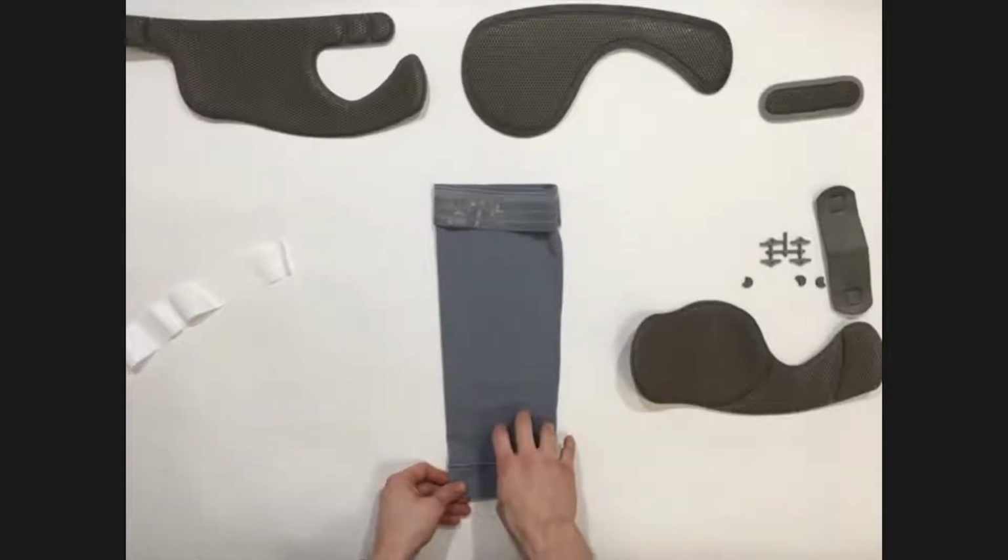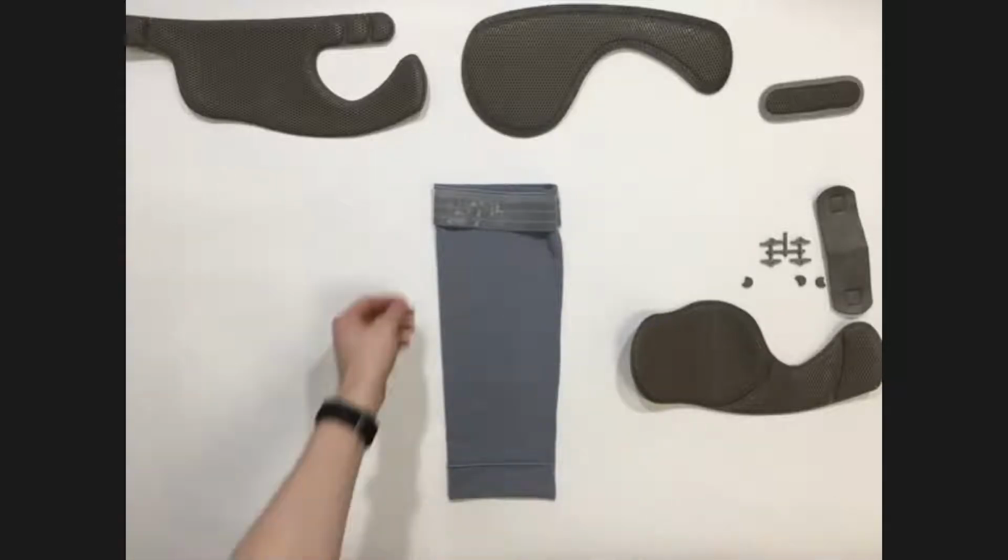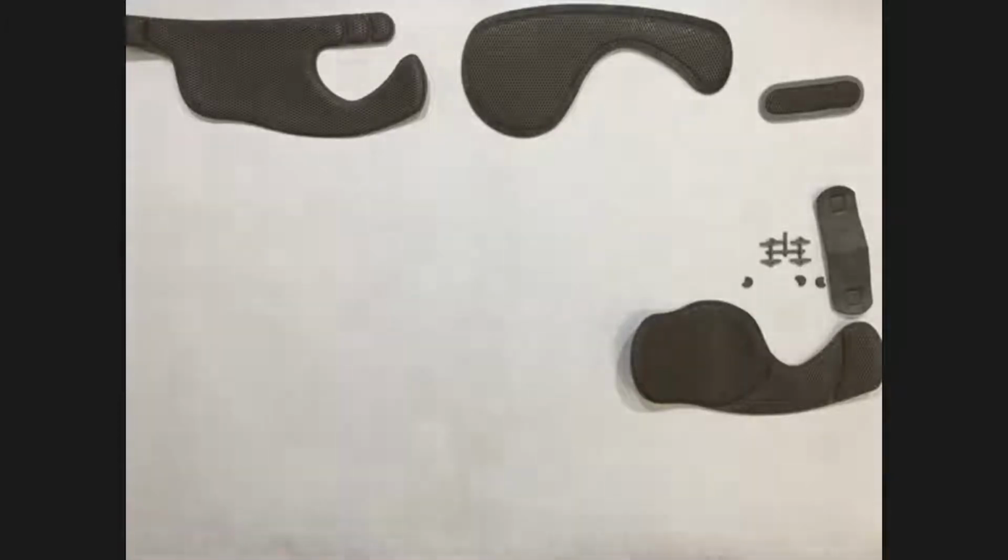So the useful thing for the sleeve is it means it can control soft tissue. So if your patient's got a lot of excessive tissue, sort of muffin top sort of situation over the straps, it can control that. And also it's a way of protecting the skin from any shearing forces from the strap. We're going to go over and fit this.